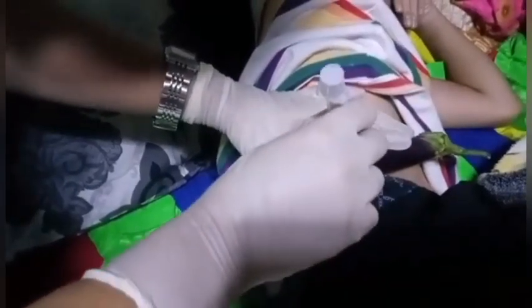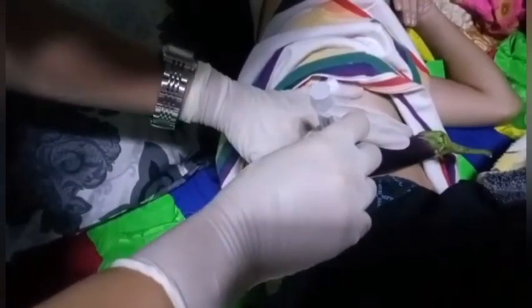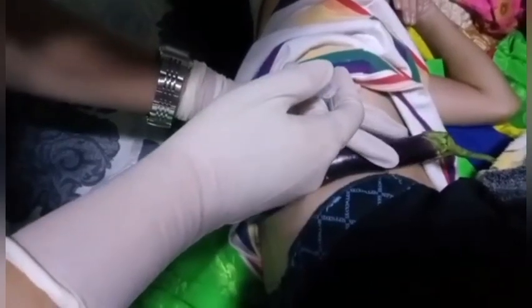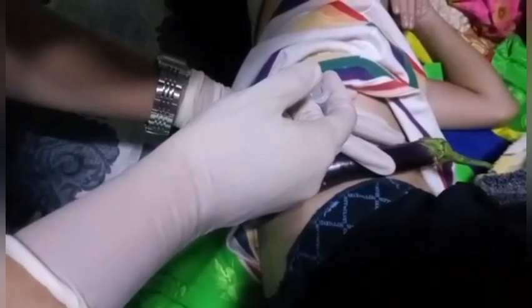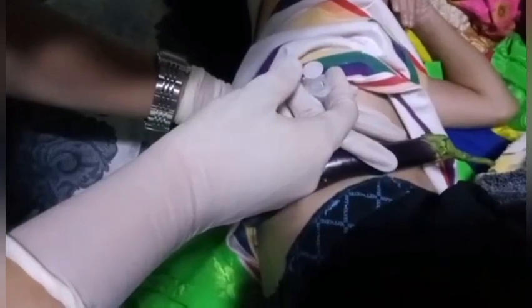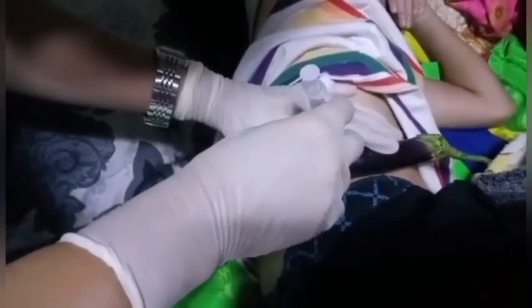Then aspirate the syringe by pulling back the plunger with your dominant hand. This is to determine if you had hit a blood vessel. If blood appears, it means you have hit a blood vessel. Then remove the needle and syringe and start over.